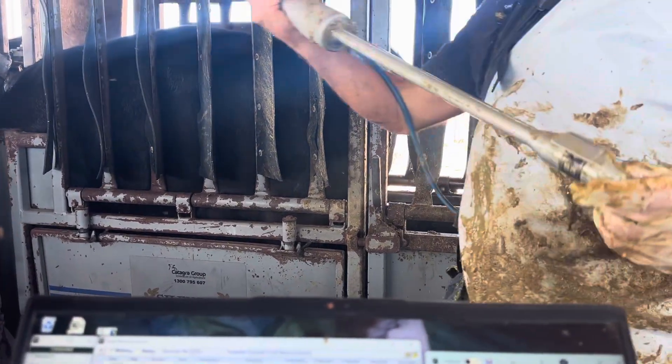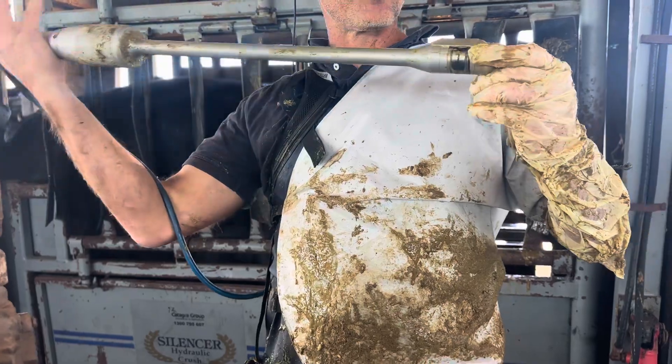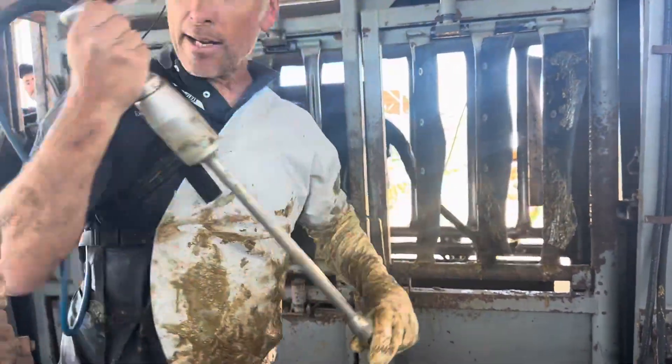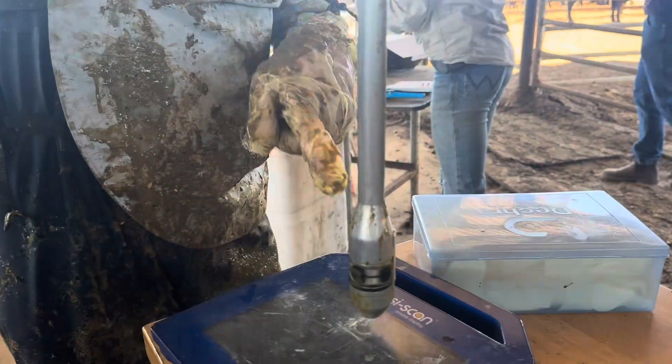This is the sector probe. Most of the standard ones are linear. This is an older style probe called a sector probe. It shoots an image. That image that you're seeing there — look here. That's the head of the probe right there, and it's shooting an image out like this.